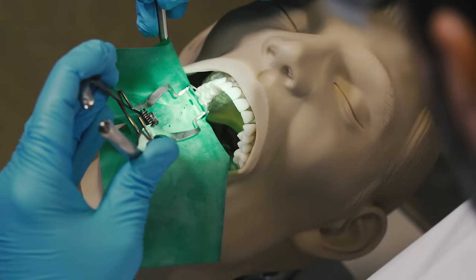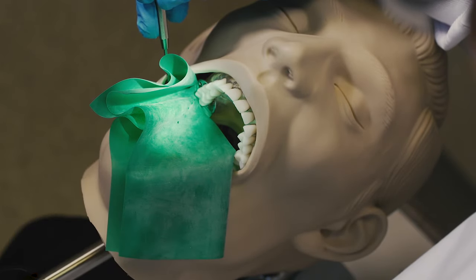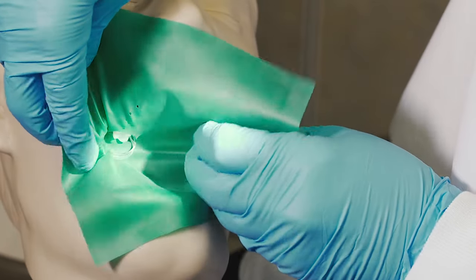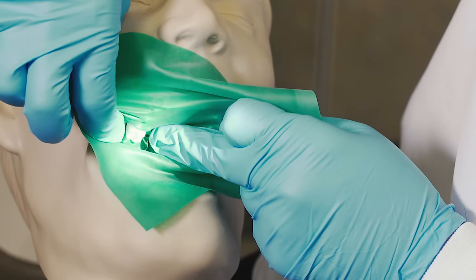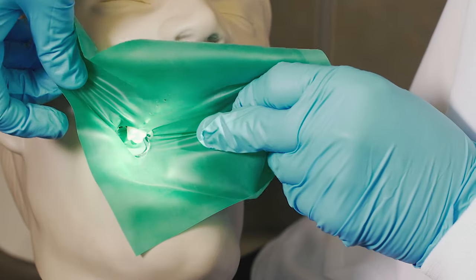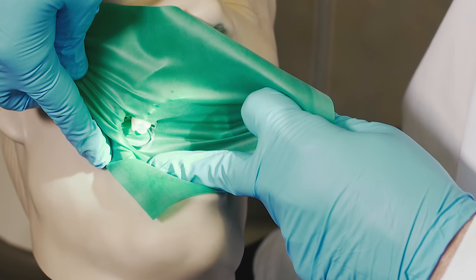Our first step is going to be to attach this W3 clamp to our abutment tooth. Once the clamp has been seated on the abutment tooth, the next step is going to be making sure that you can release the rubber dam and place the rubber dam underneath the jaws of the clamp. Now you're able to see the jaws of the clamp in the patient's mouth surrounding the tooth and the rubber dam underneath the jaws.